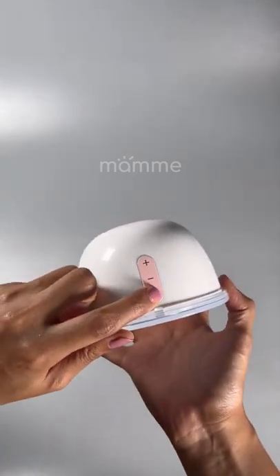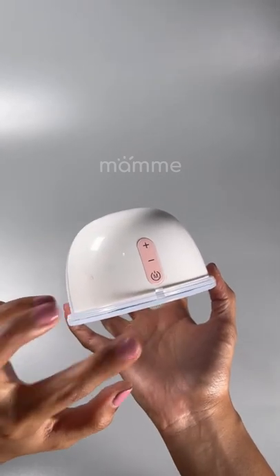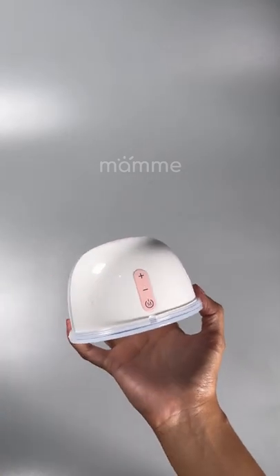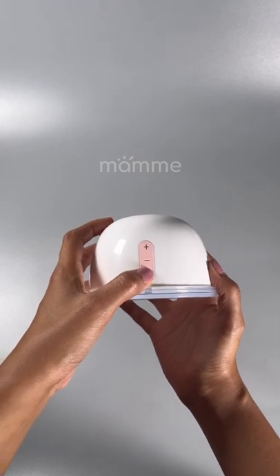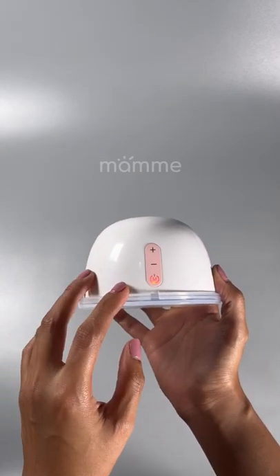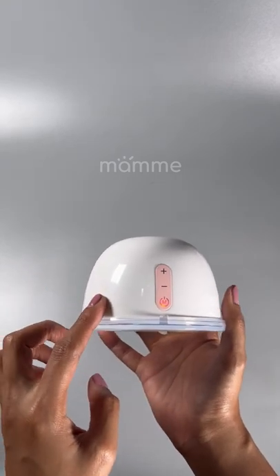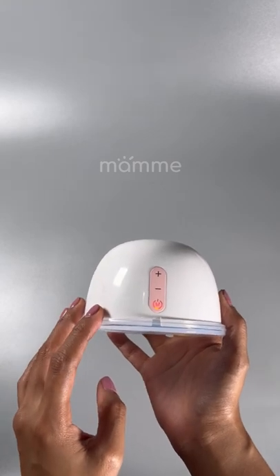Alright, sige. So, how do we close this? Just press this again until mawala. Alright, ayan. So, green pa rin yung battery na last na nakita nyo. Ibig sabihin, okay pa yung battery. Alright? What is the auto mode? It is, kapag pinopen mo si motor, it will always go to massage mode. And then, after 2 minutes, it will go to either mixed mode or expression mode, depending kung ano yung last na ginamit mo.